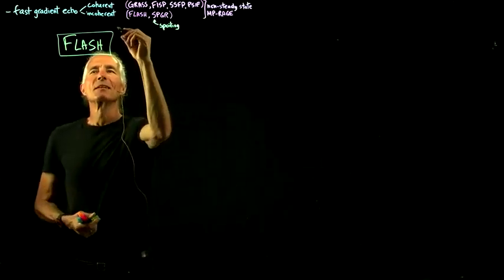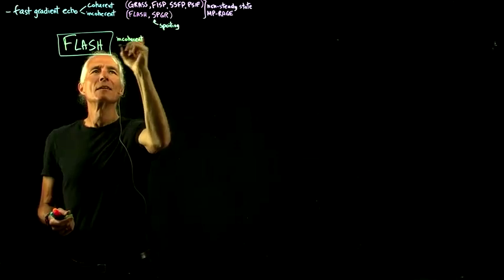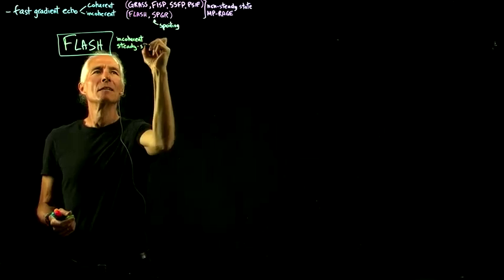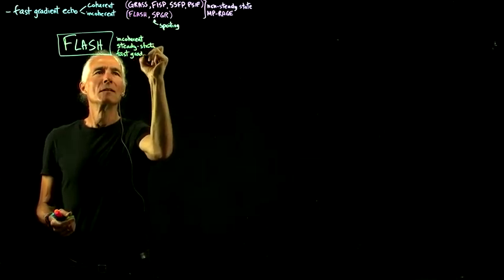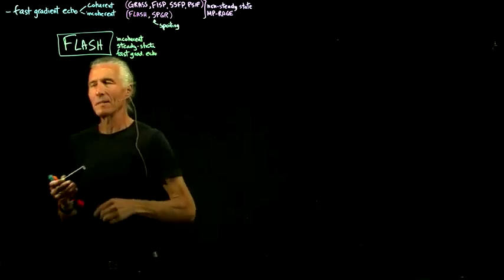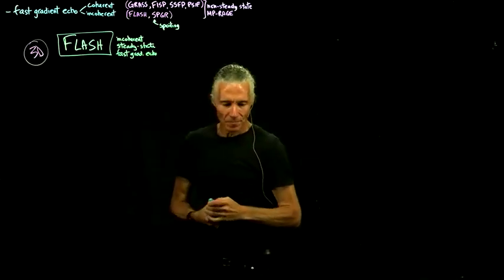It's incoherent steady state fast gradient echo. And this is a 3D version of this.